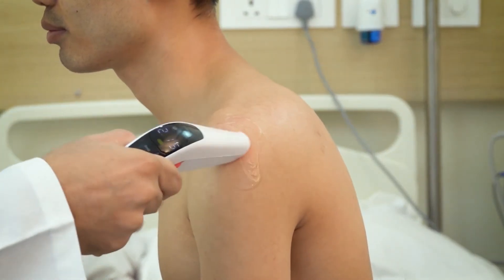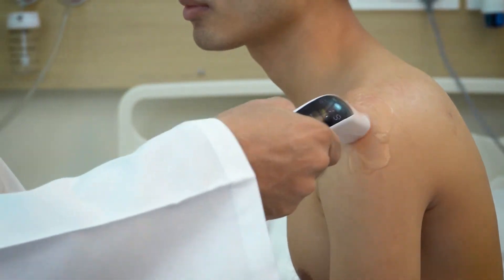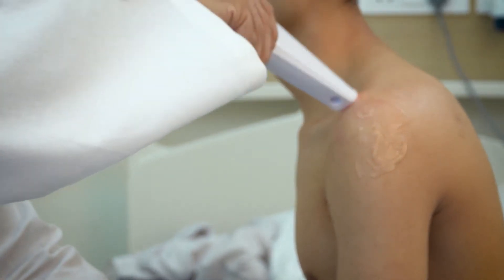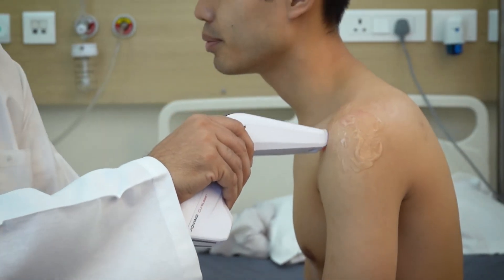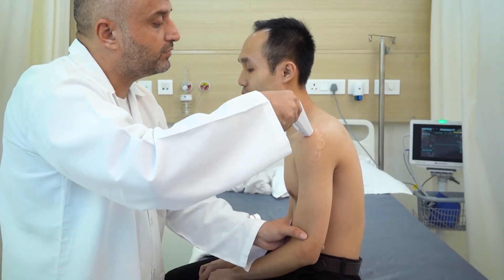Start moving the Cura laser back and forth or in a circular motion over the affected area of the shoulder. Keep adjusting the intensity of biostimulation during the entire treatment session to ensure the patient's comfort.